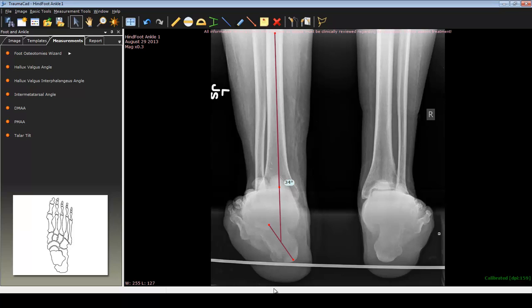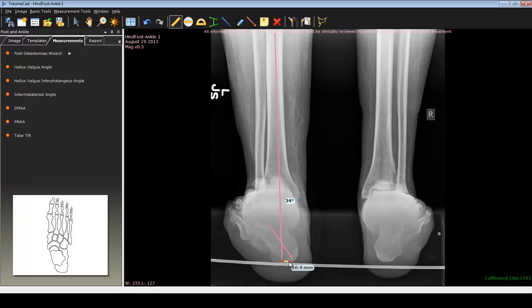So how do I plan for correction? If I look at not only the angular correction that needs to occur, but also the translational component that is present — if you extend this angle line down and make it at the same point of the calcaneus, these two points can be measured. It tells you that not only is the deformity 34 degrees, it's about 17 millimeters — the calcaneus is 17 millimeters medially displaced.